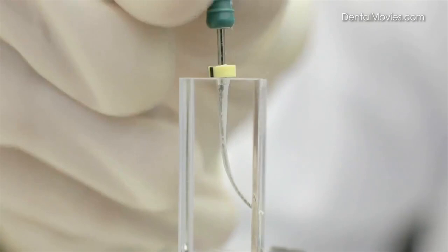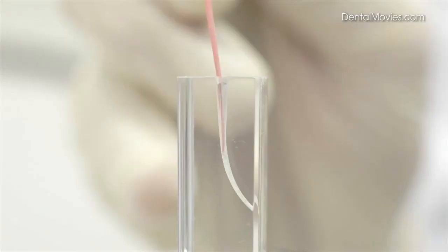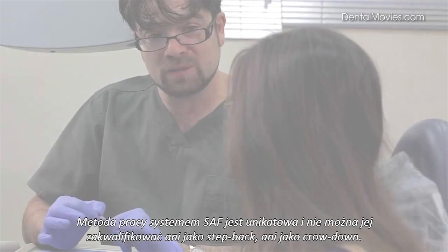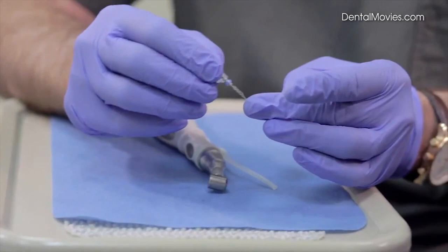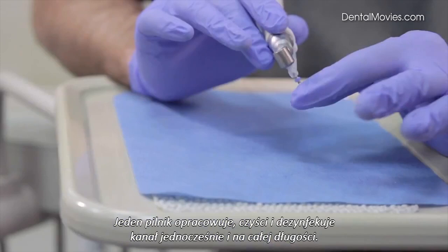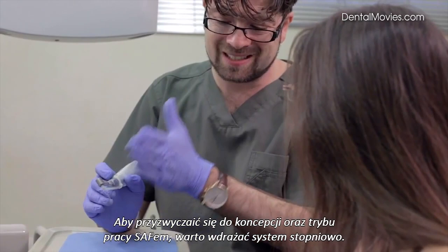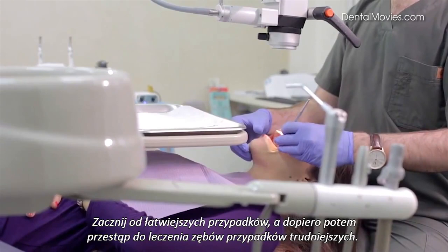More information regarding obturation after SAF preparation can be found in the SAF System Clinical Guidelines Manual. The SAF mode of operation is unique and can neither be classified as Step Back nor Crown Down. This single file shapes, cleans, and disinfects the entire length of the root canal simultaneously. To get used to this concept, adopt the system gradually into your clinical routine. Start from simple, more accessible teeth with straight canals, then move to molars.